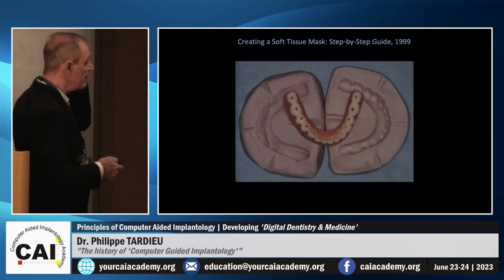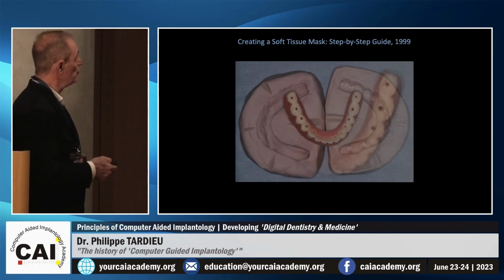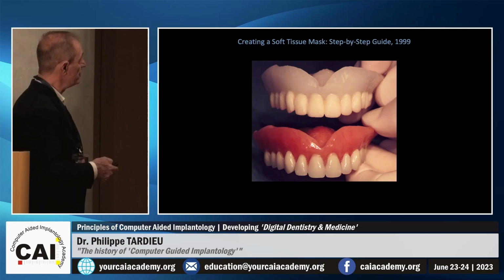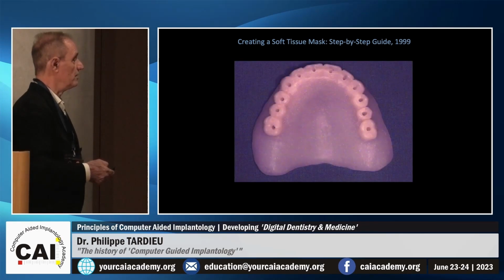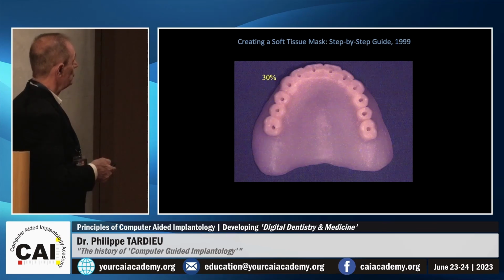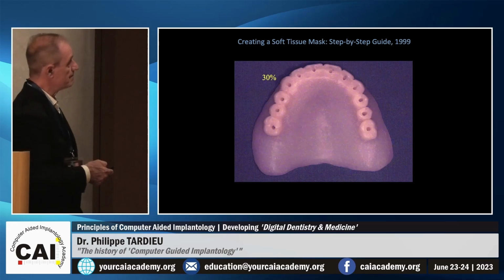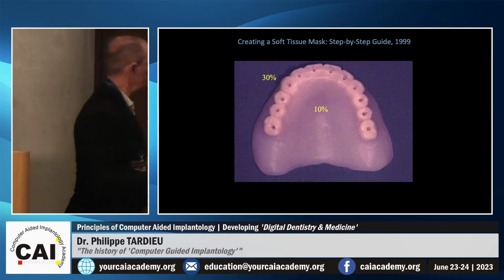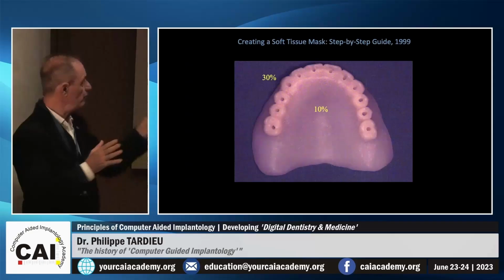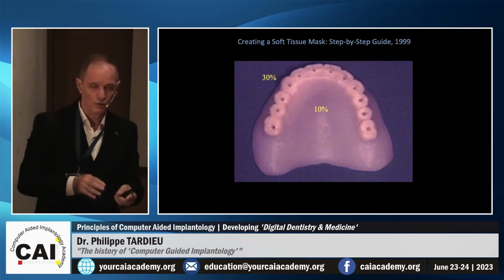and we are making a new denture, which is a scanographic appliance with holes in the middle of the teeth and two different layers of density of barium sulfate. So the first one is 30% for the teeth and 10% for the base plate. Why do we need to make 30 and 10? We've been trying 5, 10, 15, 20, 25, 30. I did that with my daughter, who is a lab technician, and we've been checking all to end with these two values. We call that a gradient.